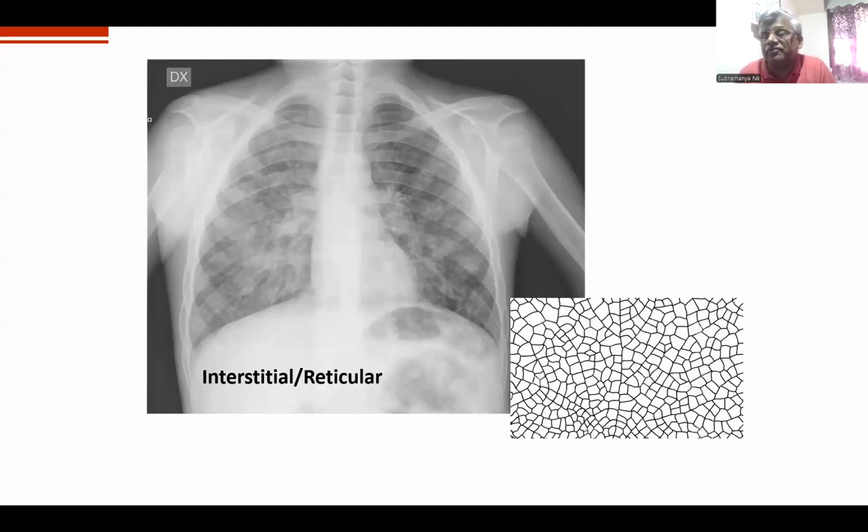Okay, you want to identify the colon in the abdomen X-ray. You can't identify the colon correctly. Suppose per rectally I inject around 5 liters of air and take an abdominal film. You can see the colon better, the margins of the mucosa of the colon better. That is what I meant by air contrast. You understand the air contrast? Please type yes. I'll give the example of the colon. If I push air through the rectum, I can see the colonic shadow better. That is what I meant by air contrast.